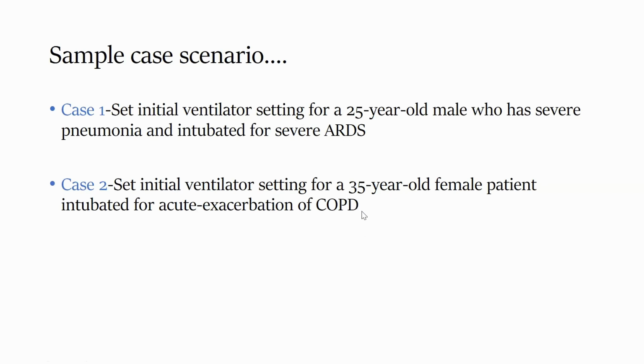I think that's important to see the difference. Okay, volume control should be avoided. I'm seeing an answer, volume control should be avoided for the second one. I don't see any reason to avoid the volume control. You can use volume control or pressure control. So the main issue is it's preferable to use volume control. What's the difference? Yes, so it can be based on experience, you can use volume control or pressure control.